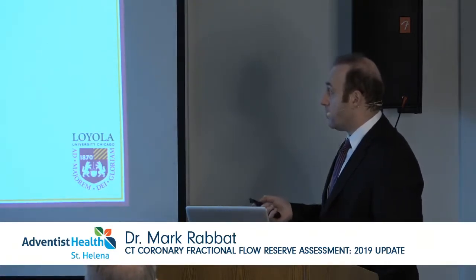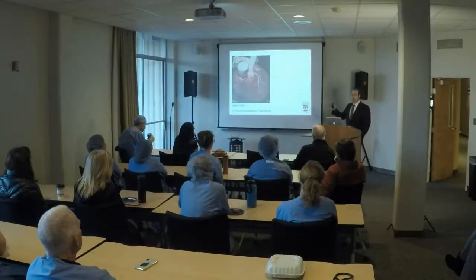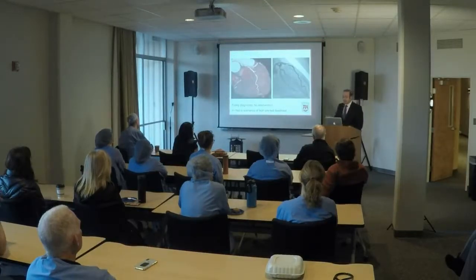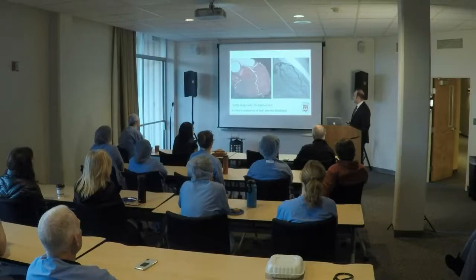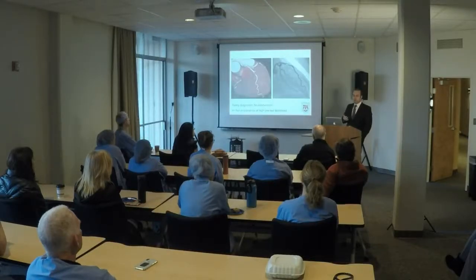Now, CTA alone is a pure anatomic assessment. Okay, we'll talk about the bridge of computational fluid dynamics to a static CT to simulate blood flow and pressure, calculating FFR later on in the talk. But if we're talking about CT alone, it's pure anatomy. So there's no hemodynamic information with a pure CT alone strategy. And it's purely diagnostic, so we can't intervene at the time of the acquisition, and it shouldn't really be done in patients who are toxic, hot-looking, positive biomarkers, dynamic EKG changes. Some patients need to go straight to the cath lab, right? So we're talking more intermediate risk patients, if you will.